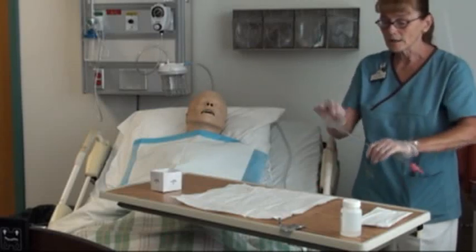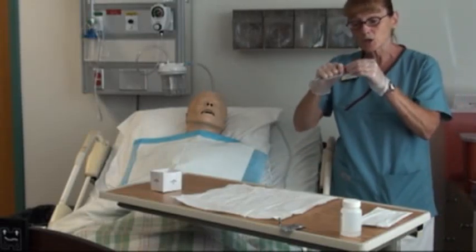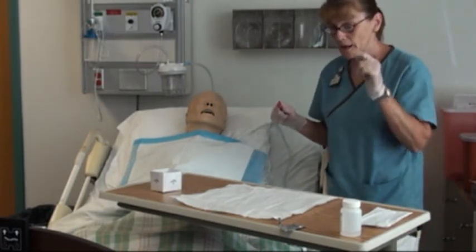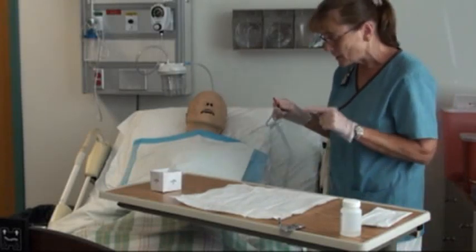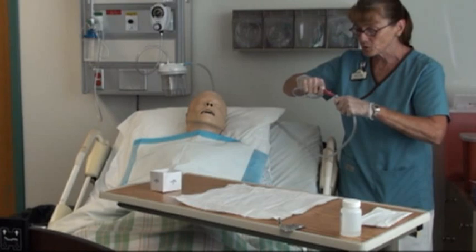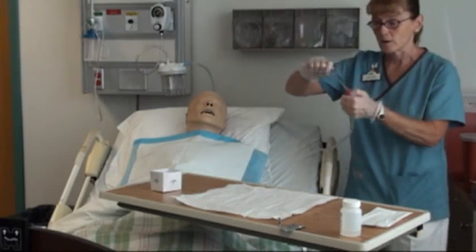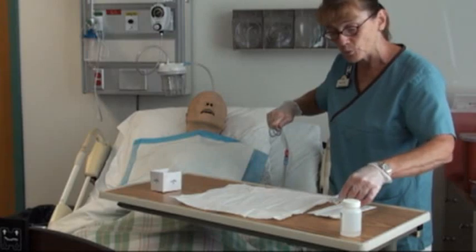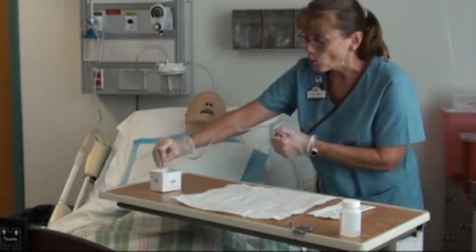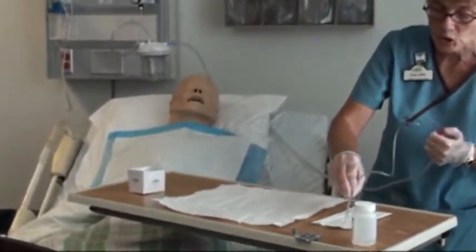Right now the whole suction catheter is sterile. Once you connect the surgical tubing to it and touch there, the pink part in back is not going to be sterile. Make sure you've got what you want. I'm going to put the lubricant over here on my field where I need it. My left hand is now contaminated. Once I push this on, from the pink part back will be considered contaminated — only from the clear plastic forward is sterile. I'm going to apply lubricant here. Let's put it in the water first just to check our suction and make sure we've got it. Then just lubricate a little bit — about an inch, an inch and a half.